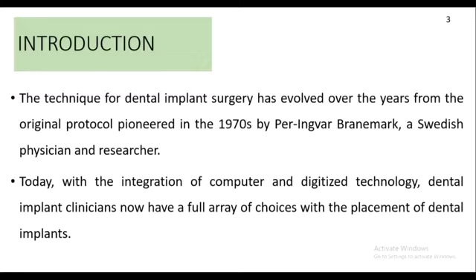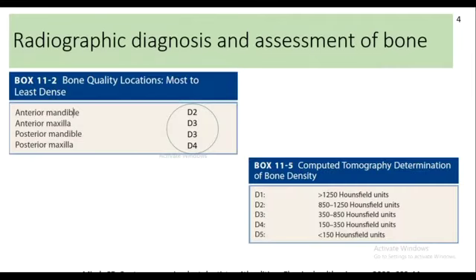Coming to the introduction, the technique for dental implant surgery has evolved over the years from the original protocol pioneered in 1970 by Brånemark, a Swedish physician and researcher. Today, with the integration of the computer and digital technology, dental implant clinicians now have a full array of choices for the placement of the dental implants.